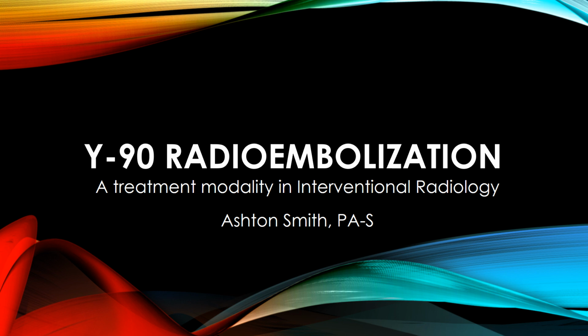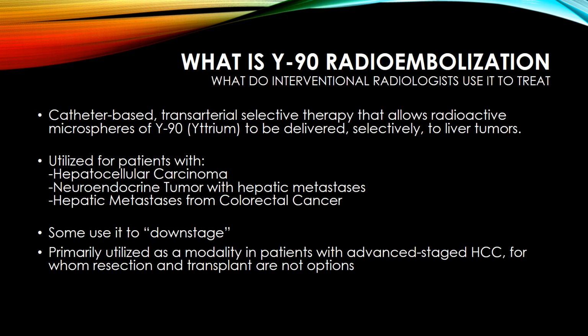Thank you for joining me as I present Y90 radioembolization, a treatment modality in interventional radiology. Y90 as a treatment is a catheter-based procedure. We use the radial or femoral artery that allows us to selectively introduce radioactive microspheres to liver tumor tissue.